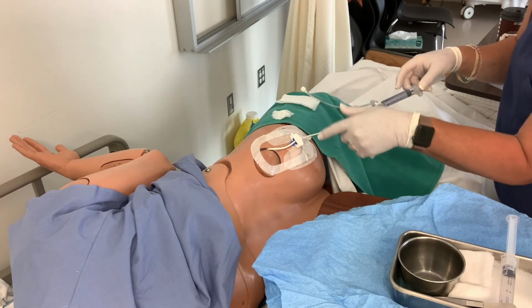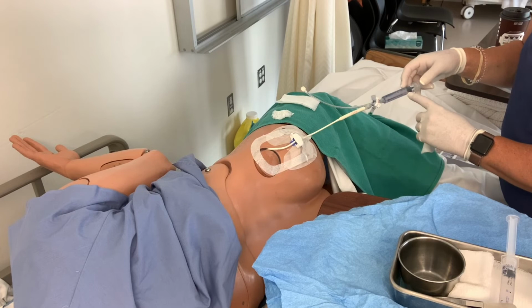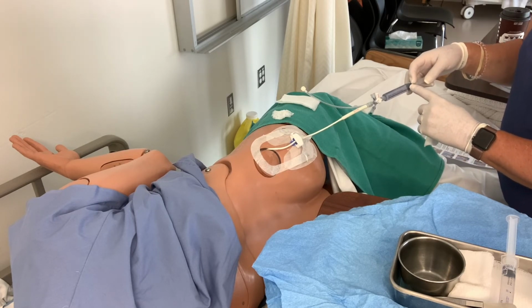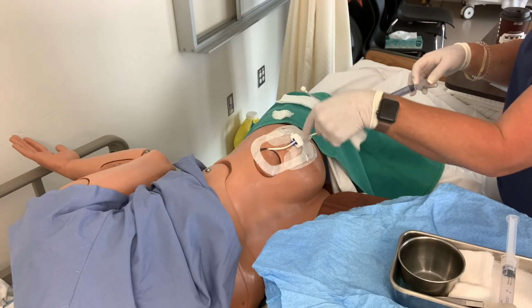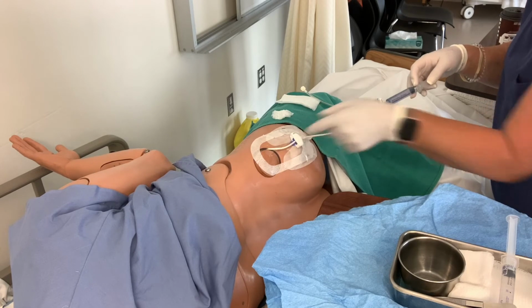If the patient feels any pressure or any pain, you need to stop. But technically, it's kind of like rinsing the dishes. There's a pocket of pus or a pocket of fluid we're trying to get out of there. So this is just putting it in and washing it on the inside.